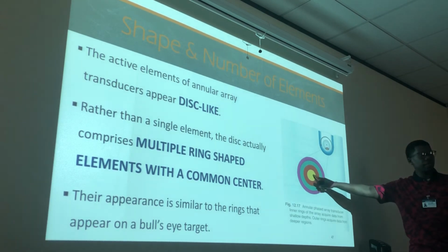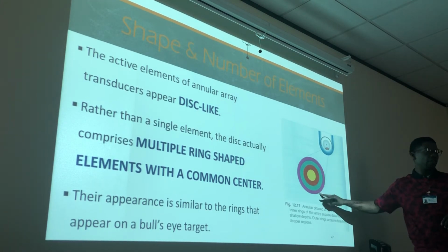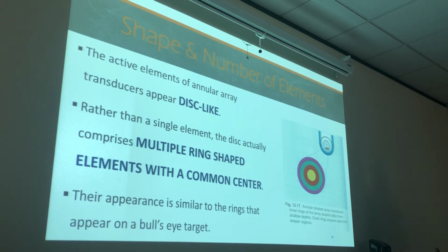So this depth right here is going to be for shallow, right? Because it's the smallest diameter in a direct relationship. So small diameter crystal, shallow depth, right? And as it goes out, it's going to go deeper. Okay, so this transducer is able to have multiple focuses at different depths. This appearance is similar to the rings that appear on a bullseye target. Remember that, how you remember annular phased array transducer. Kind of looks like a bullseye target.